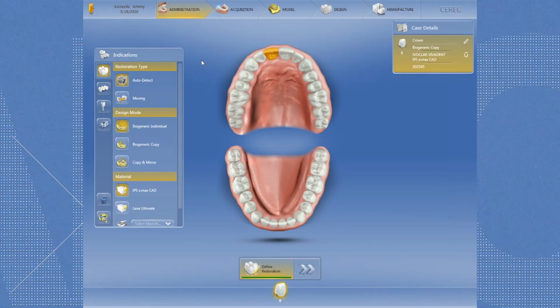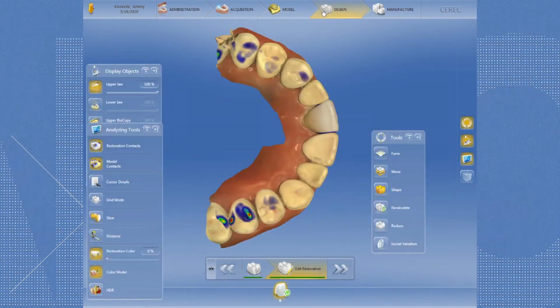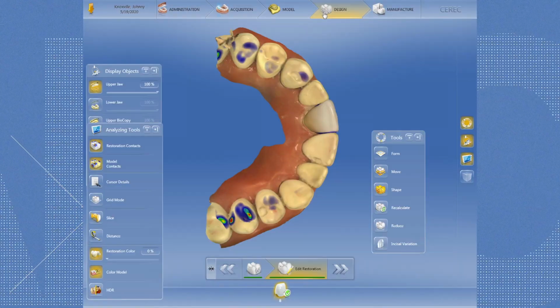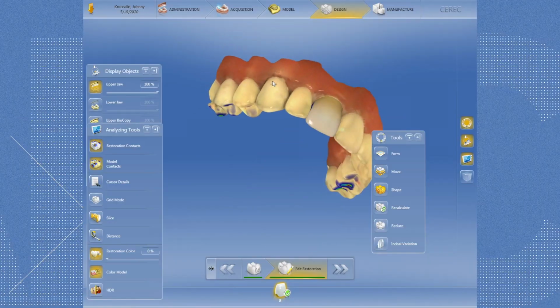And then I go through the whole process of scanning the model, scan the upper arch, the lower arch, scan a bite, and then we go through the model work where we orient a cast. We basically tell the machine where the margin is going to be located so it doesn't have to guess there. Although the newer software does tell you where the margin is, but it's not always perfect, so I like to double check that. And then we go into the design phase where we actually design this restoration.